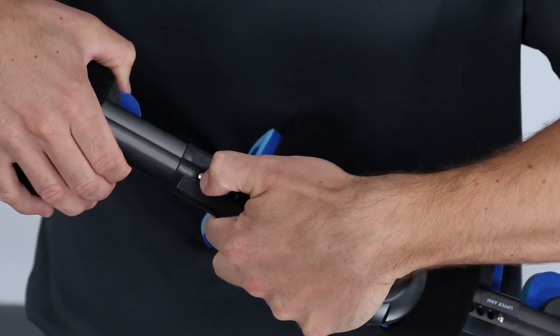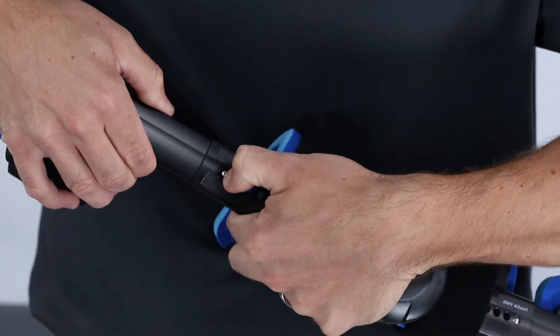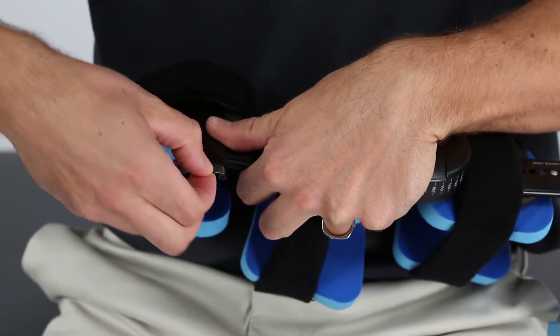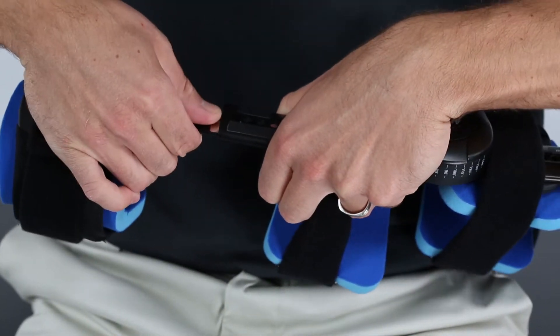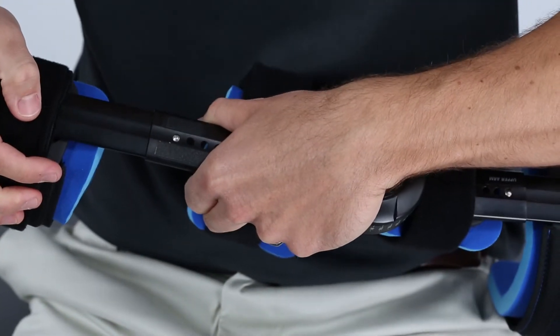Note that extending the strut length beyond the last adjustment hole may cause the leaf pin to fall out of the strut. If this happens, reinsert the leaf pin into its housing and reconnect the two struts.